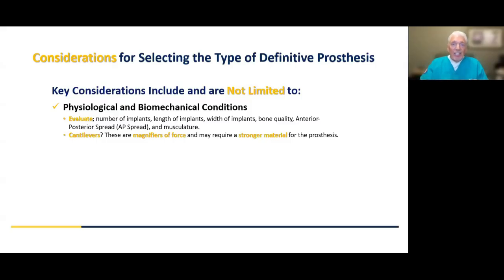And I emphasize cantilevers here because, keep in mind, cantilevers in implant dentistry are nothing more than magnifiers of force. That may make a difference in what material is going to be utilized. Again, these are things you need to be talking about pre-surgically. I'm sharing this with you now because we're talking about final restorations, but I wanted to bring this up because these are important considerations to be thinking about pre-surgically, okay?